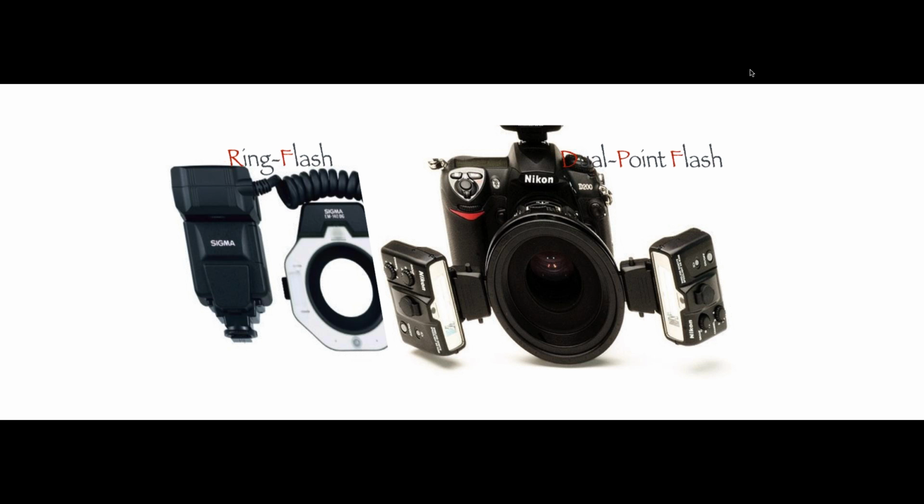In my case, I just use two different flashes because I try to focus more on the aesthetic portion of my practice, because I actually teach aesthetic dentistry. So obviously I've got to have a lot of high quality, very aesthetic photos, but at the same time, photos where I can better control the light. Because at the end of the day, controlling the light is key for aesthetic dentistry.